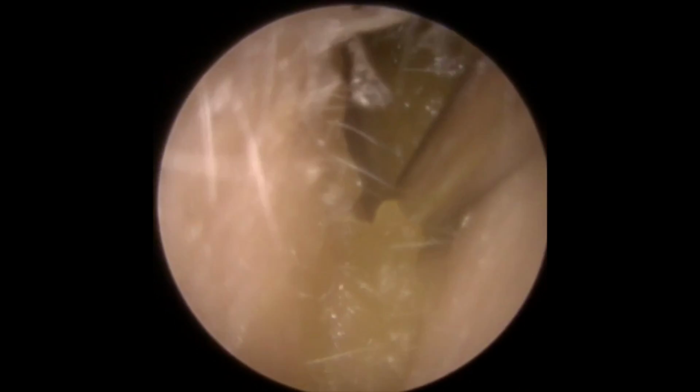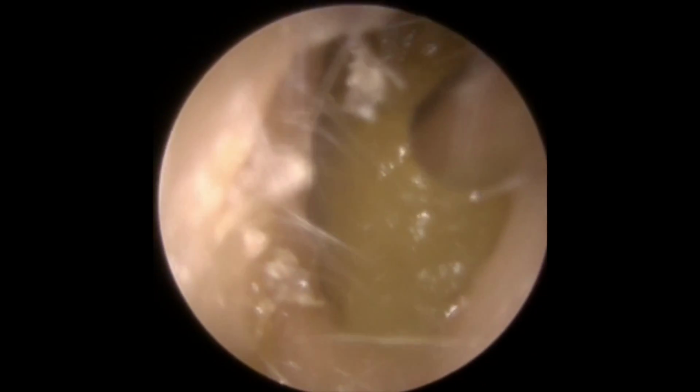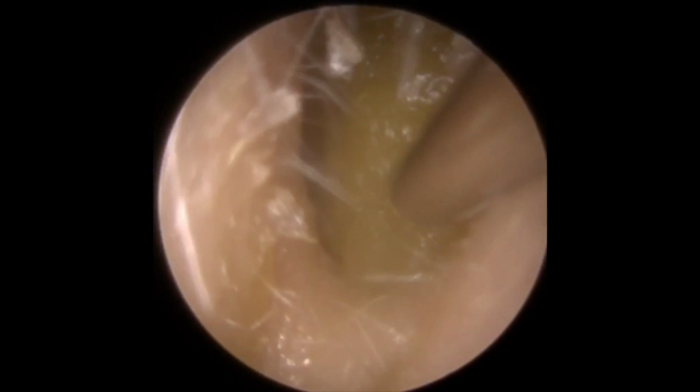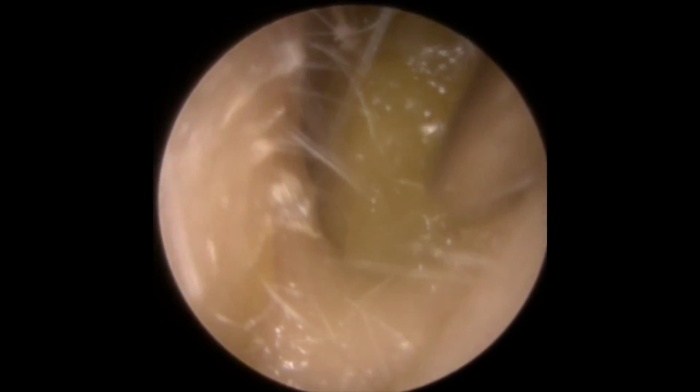The reason that she was going through there is because we've got very narrow ear canals. Now, the difficulty we have today is obviously instead of having 6 months worth of wax to take away, we now have 3 times as much as we normally would. So this lady's ear canal is very narrow at the entrance and then widens out quite a bit just as you get about quarter to a third of the way in, which is what you can see here.